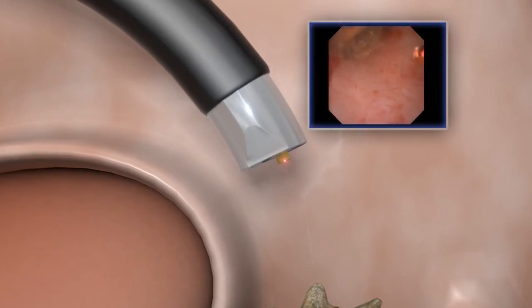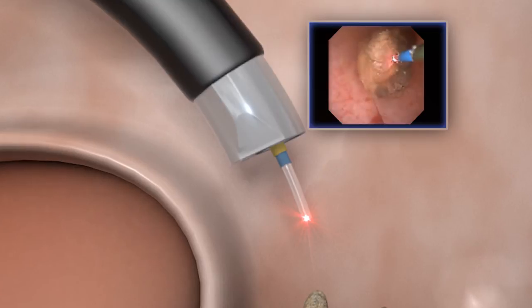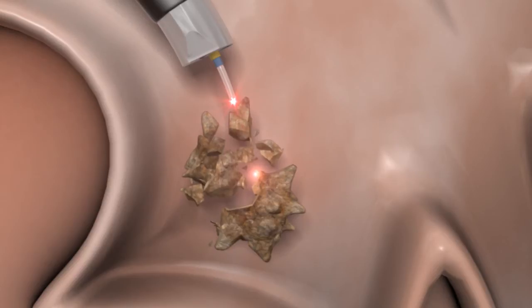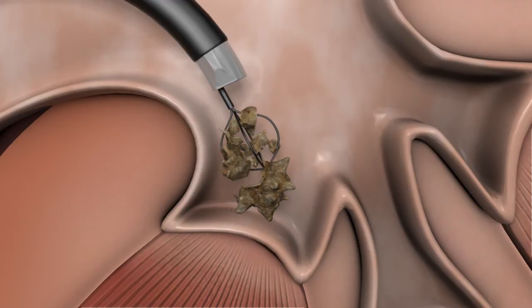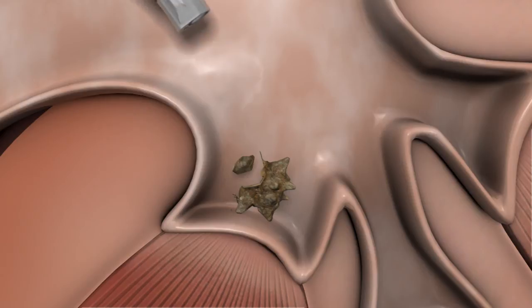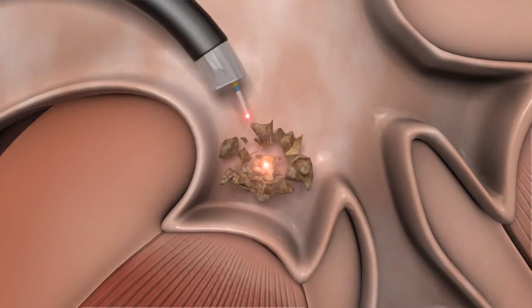The scope safe laser fiber is advanced from the multi-pass sheath, and the stone is ready to be treated. The laser energy is applied to fragment the stone. Stone fragments are removed using standard retrieval tools. And no matter how many laser fiber insertions the procedure requires, the multi-pass sheath continues to protect the scope.